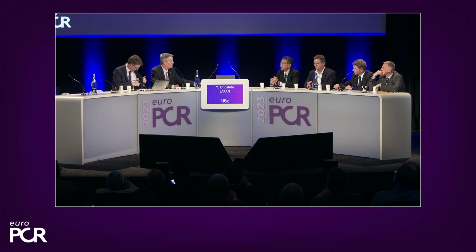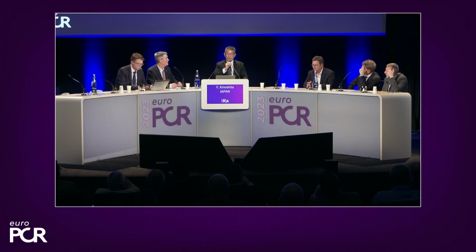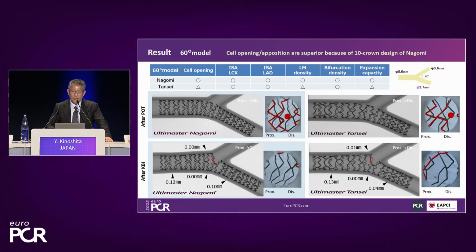Thank you. Now we are back here, and Dr. Kinoshita would like to show a direct comparison in a bench with potential advantages of Nagomi versus Tansei. Thank you, Goran, so I would like to continue with the results of my benchtop test.